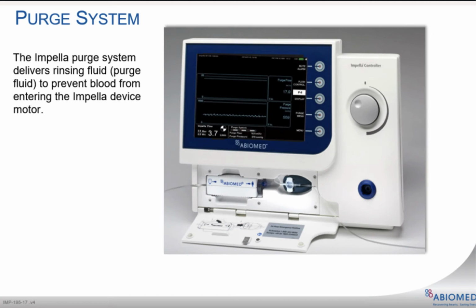The Impella system requires a PURGE system to deliver a rinsing fluid to the Impella catheter. This rinsing fluid, also called PURGE fluid, helps to prevent blood from entering the motor. For the automated Impella controller, the PURGE system consists of an integrated infusion pump, PURGE disc, and PURGE tubing.